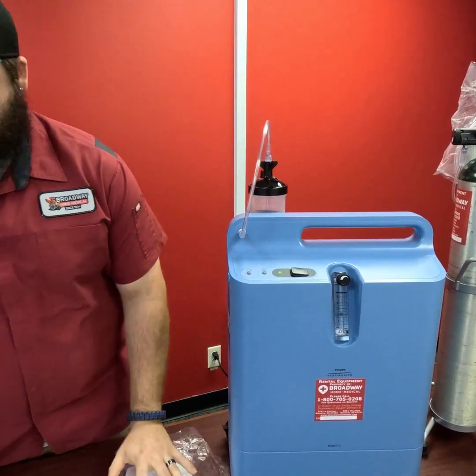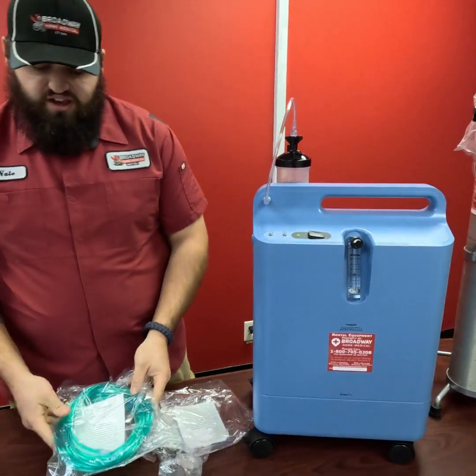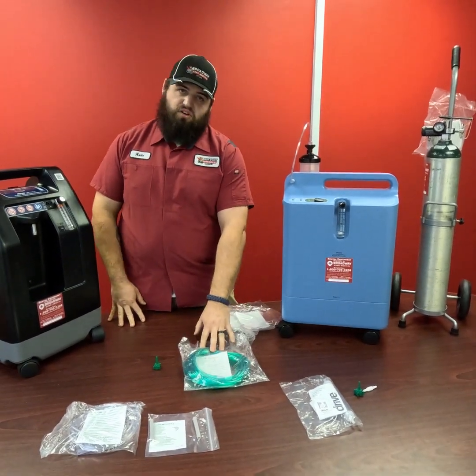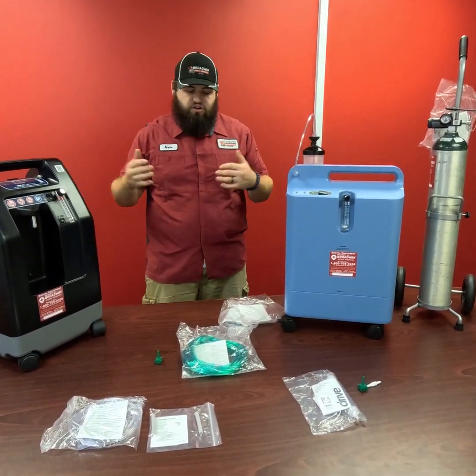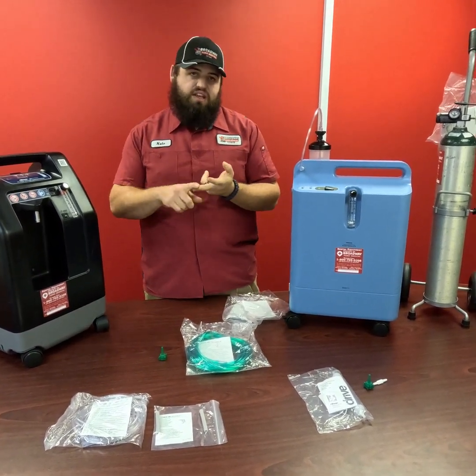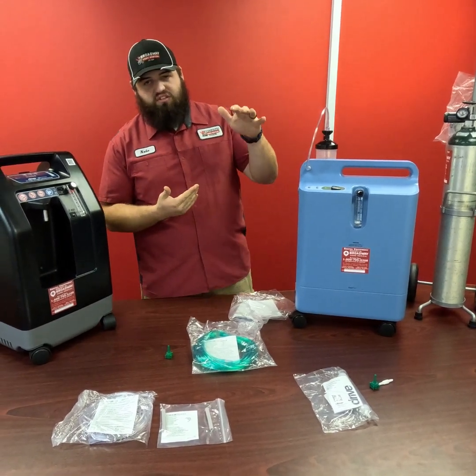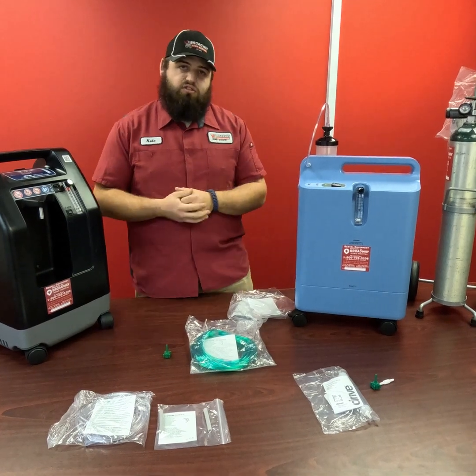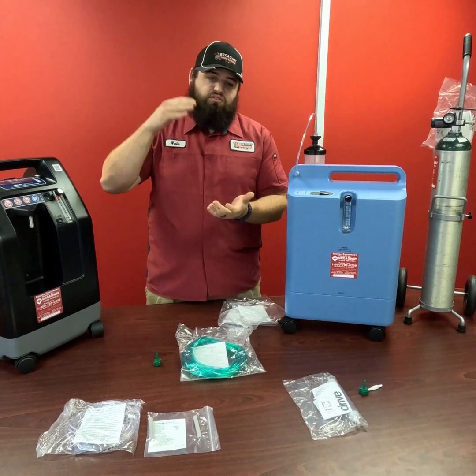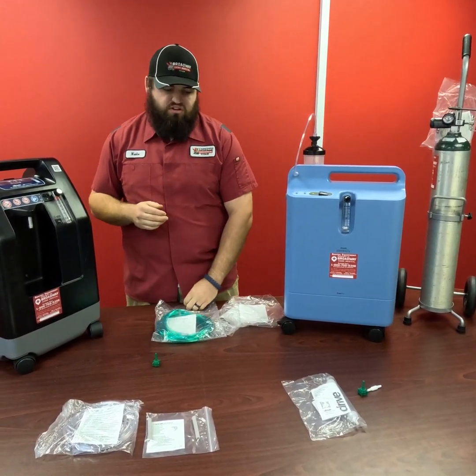The next thing that I want to discuss is going to be extension tubing. We do have different lengths of extension tubing. This is a 25-foot hose, so it can stretch you pretty far. We do have a 10-foot hose and a 50-foot hose. Generally, we do recommend to stay under that 50 feet of extension tubing, due to once you go over 50 foot, you do start to lose pressure at the end of the line. And we don't necessarily want to do that.